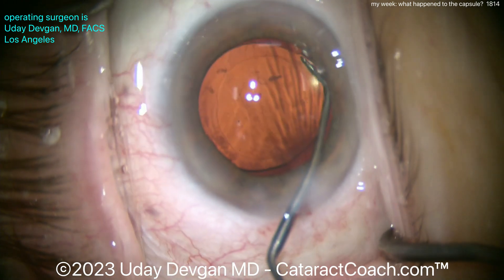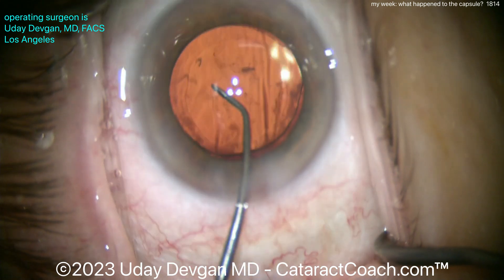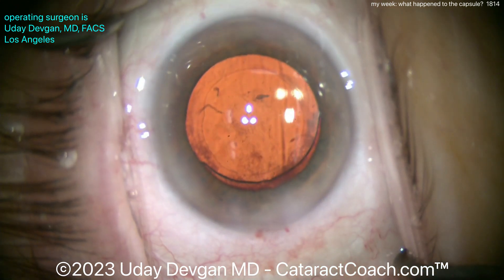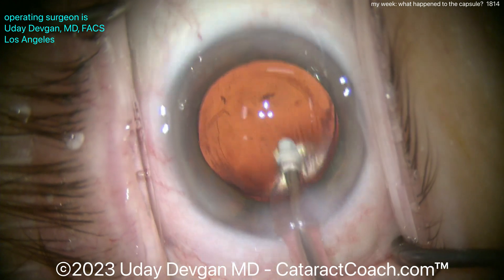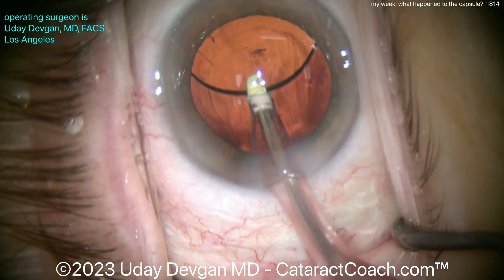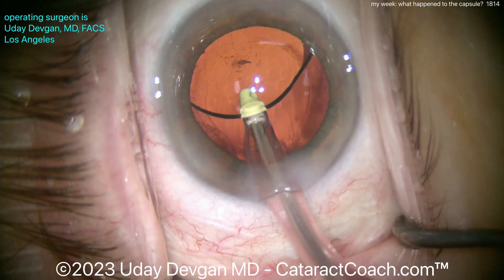Get that lens centered up — it looks pretty good. Good rhexis coverage and reasonable support. I'm rotating it so that one haptic is in the top right of the screen, where I noticed the capsule wrinkling — where I got the title slide picture from. Just to have that haptic as an extra bolster in that area. Now removing viscoelastic from underneath the optic.